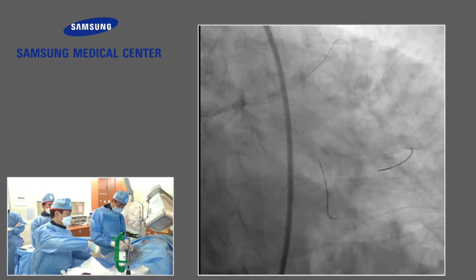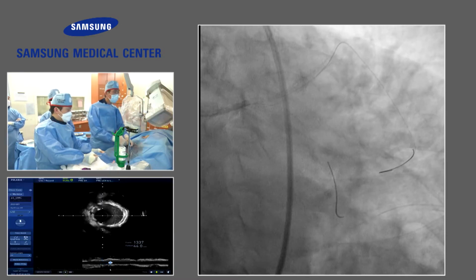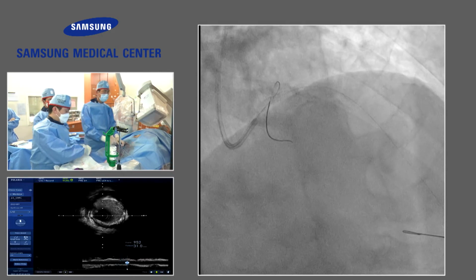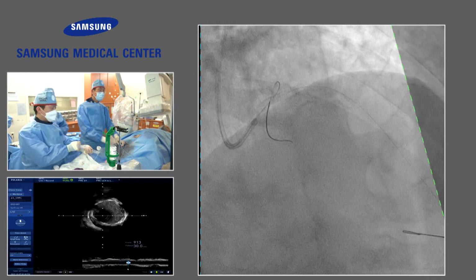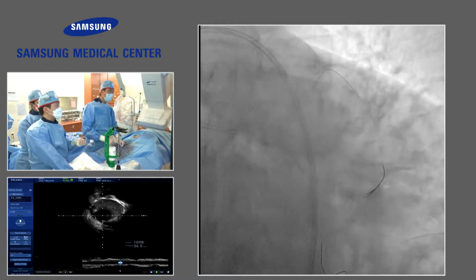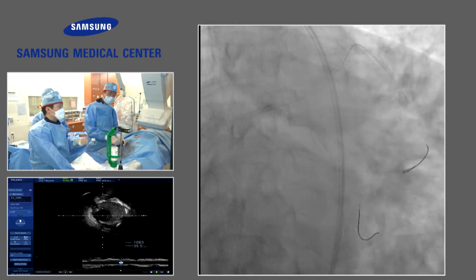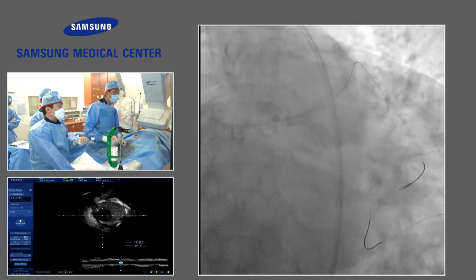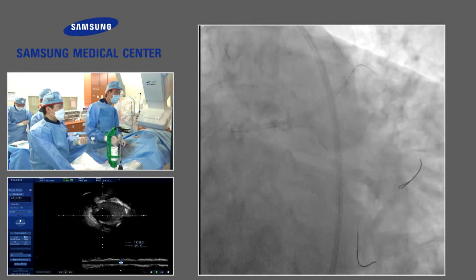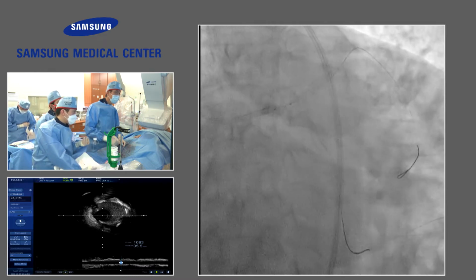Okay. The most proximal several stent struts are not apposed to the left main wall. Thus, you are going to do a POT using a 5.0 balloon. 4.0 now. So a 4.0 vessel balloon? The vessel size measured in IVUS is 4.5, but the vessel is getting large. But the usual practice is actually, after POT, we do the IVUS, but for education purposes.